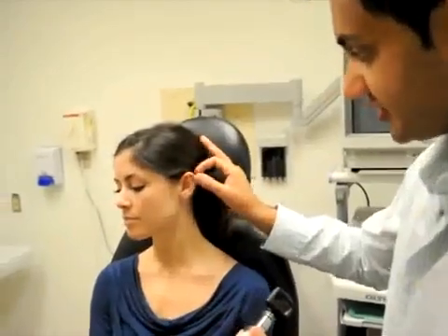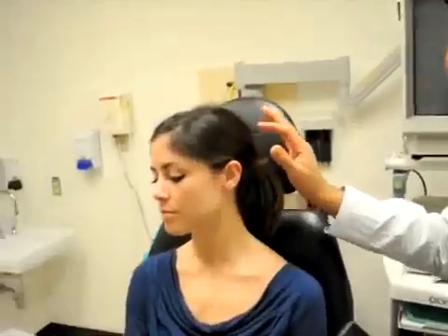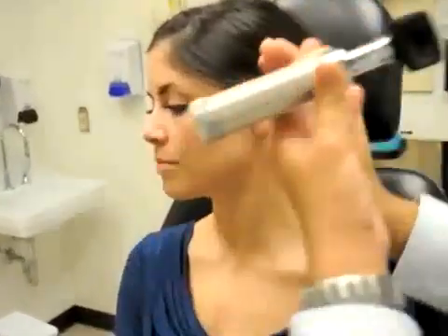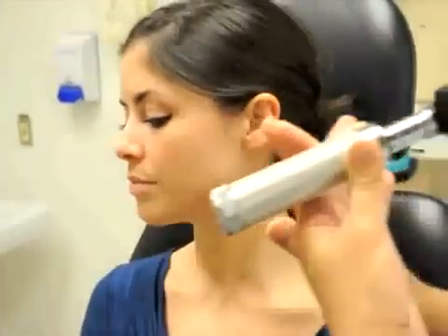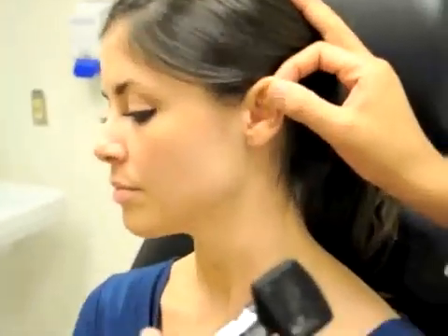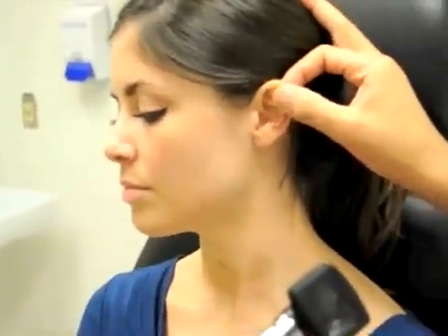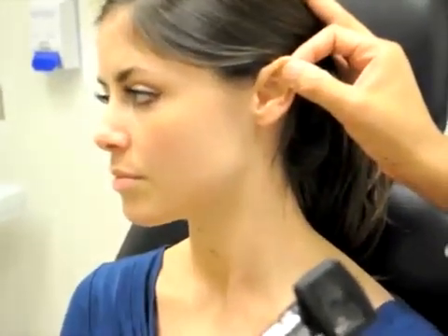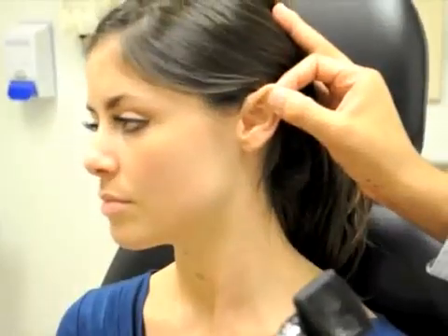Before I insert the otoscope, I need to ensure that I do not cross my hands. So I use one hand to grab the pinna of the ear and pull it up and outwards in order to straighten the external auditory canal.